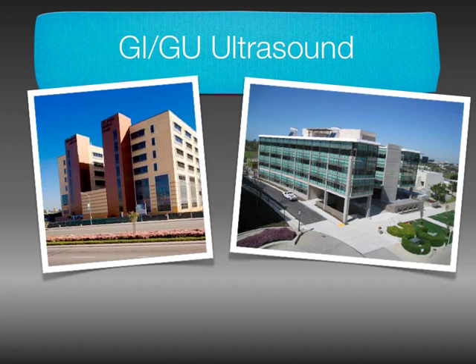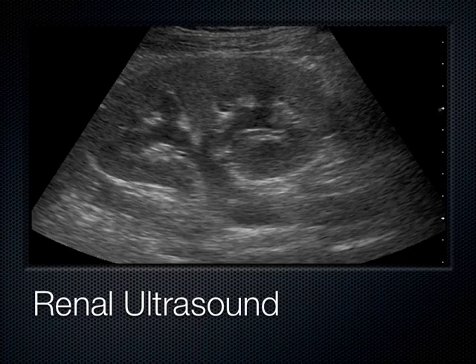So we're going to quickly transition today into the kidney and also some intestinal structures and the gallbladder. So this is the kidney, and you can see it here in all its splendor and glory. But to talk about the different anatomical parts of the kidney, this is the capsule of the kidney out here. Now the capsule is a very rigid structure, and when the kidney expands, it's got nowhere to go. And so it causes the patient a lot of pain if the kidney gets obstructed. For example, when the urine tries to make itself out the ureter, if the ureter is obstructed by a kidney stone, the kidney can't really expand, and so that's what causes such terrible colicky pain.